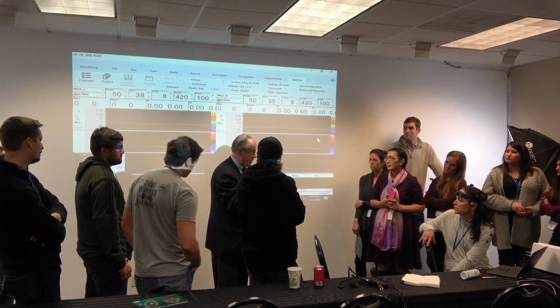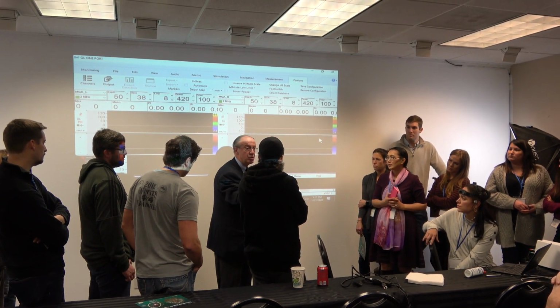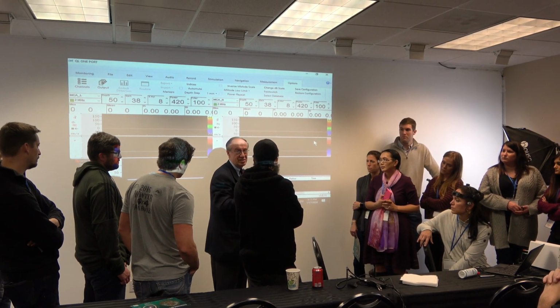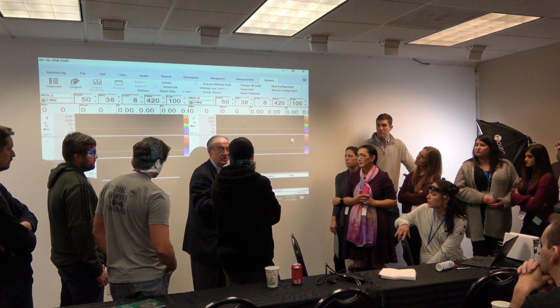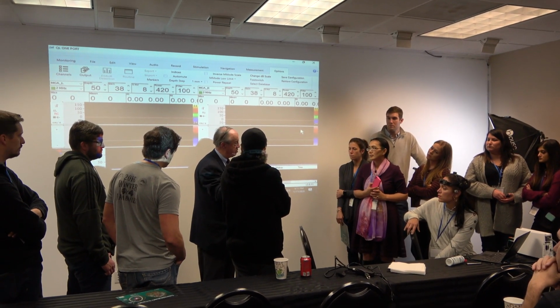What it means, when the gates open, the ultrasound goes based on the time, for 2 centimeters, for 5 centimeters, for 10 centimeters, etc. So it is the main reason when we are doing TCD we need to use pulse wave technology. That will be defined based on PRF, pulse repetition frequency.